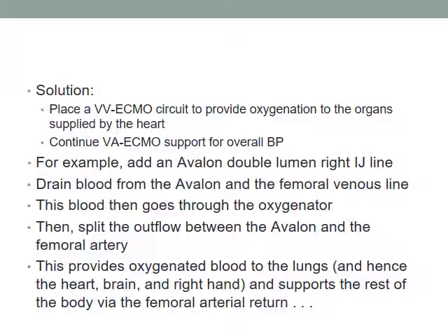Will it be split even? Will most of it go to the aorta? Will most of it go to the right atrium? Right atrium. Why? Low pressure, exactly. So the pressure is lower there, and blood takes the path of least resistance, right? So we actually have to put a clamp on the venous outflow so that the pressure goes up and it doesn't all go to the right side.